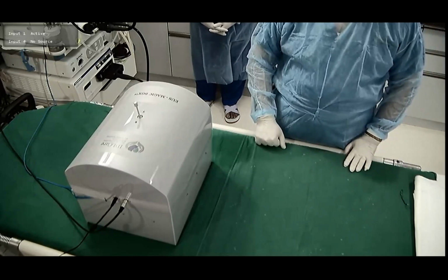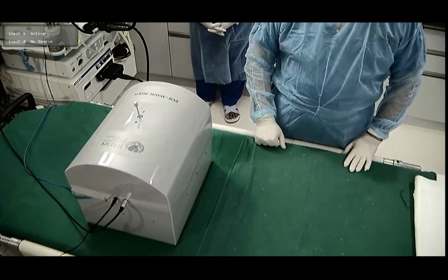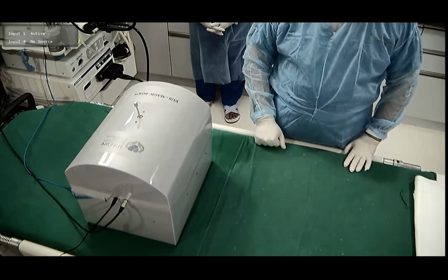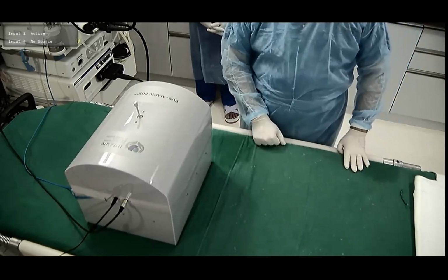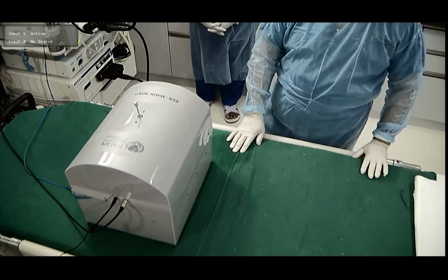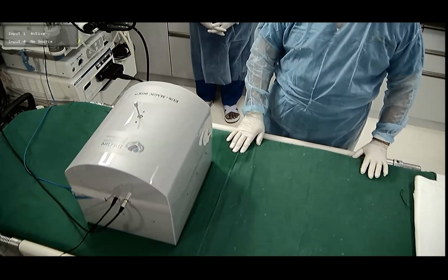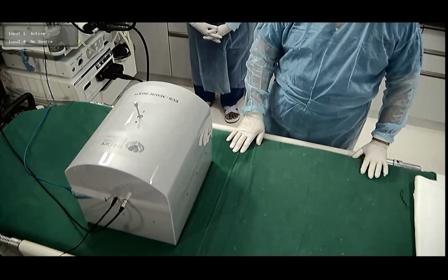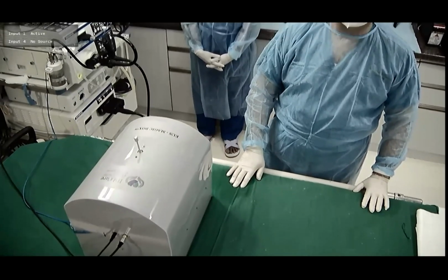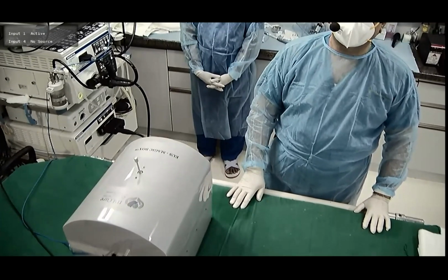We published it in GI Endoscopy, but the model was very basic, so many things could not be done. Later on, we realized that with 3D printing the material is pretty stiff, and we were not finding a solution to have a material where we can puncture, dilate, and place a stent. So we shifted to hybrid models where we had silicone tubings and a mixture of stomach and duodenum.